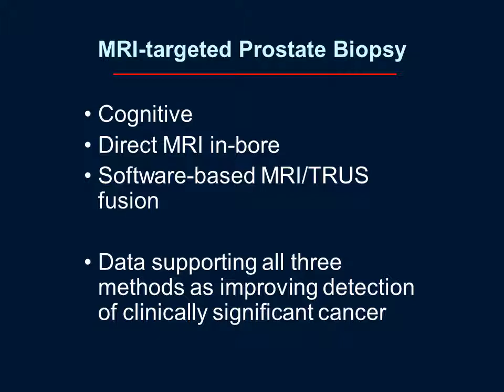Direct MR-guided biopsy within the bore of the MR gantry itself, as well as real-time software-based MRI ultrasound fusion biopsy. So in other words, targeting under ultrasound, but fusing to the MRI to sample the lesion. And there's data supporting all three of these methods as improving detection of clinically significant cancer, at least compared with a standard non-targeted systematic biopsy.